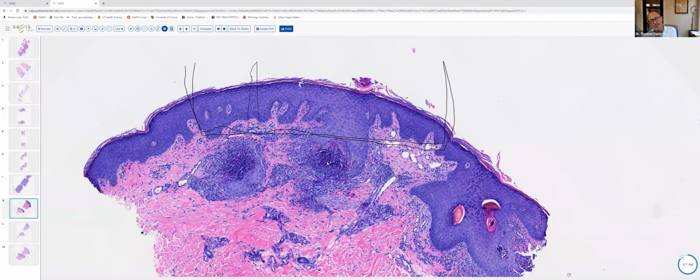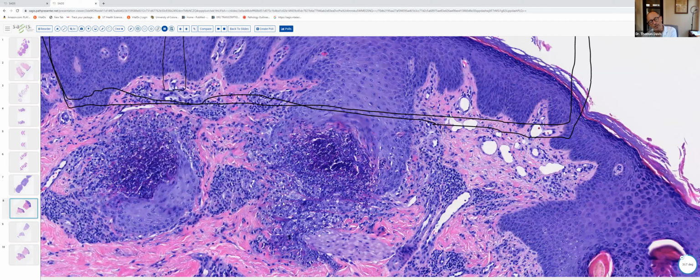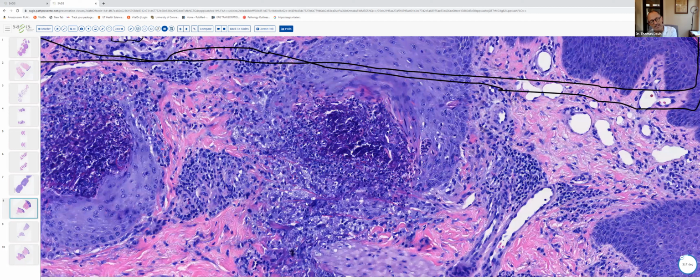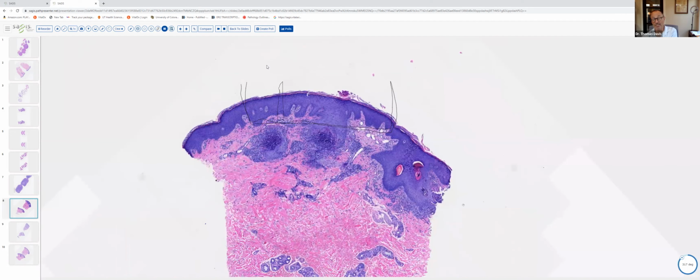In that particular instance, however, the elastic fibers that are being transepidermally eliminated are calcified. And so rather than being eosinophilic, they're going to be basophilic because they're encrusted with calcium. So elastosis perforans serpiginosa can be seen in a variety of clinical settings, and I would definitely know the various settings in which we can see EPS, and of course, clinically, very distinctive.